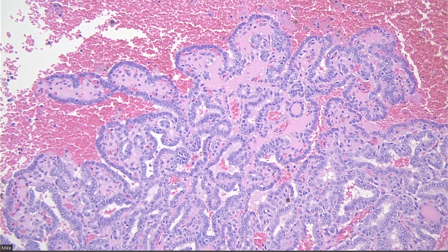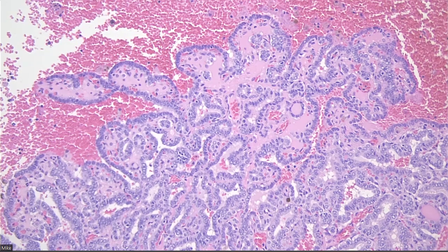In the NIFTP criteria, the revised criteria from 2018, it went from less than 1% to 0% allowed. But now there are papers in the literature saying we've shown that even up to 1% papillae still don't metastasize and still do really well prognostically. So I don't think it's quantity. I don't think it's 0 or 1. I think it's quality of the papillae in combination with the genetics.